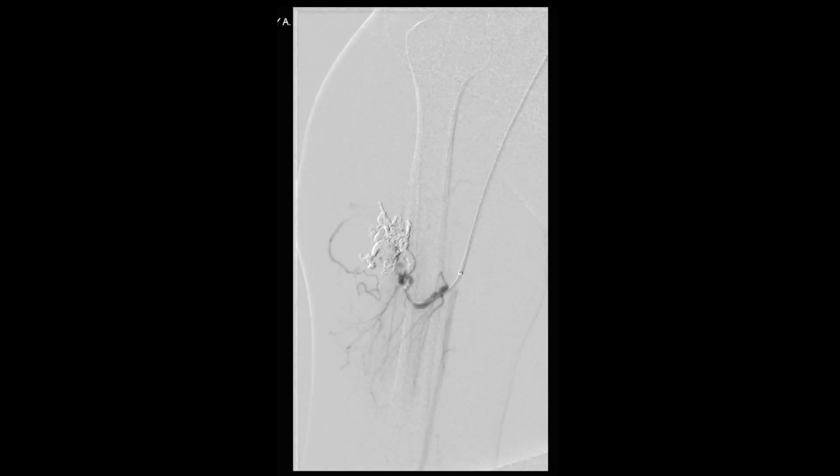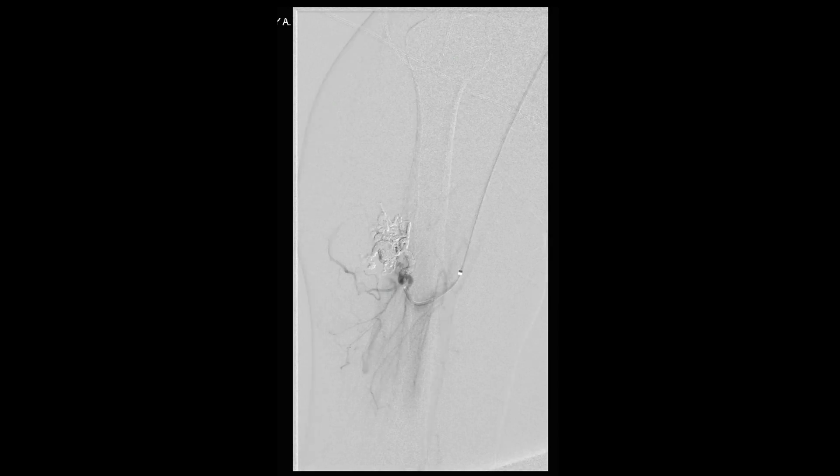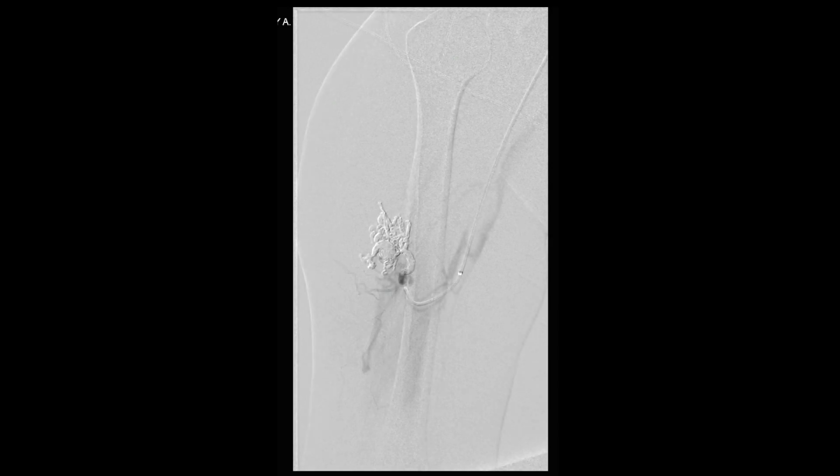A repeat angiogram was then performed that demonstrated cessation of flow into the AV malformation from this branch of the brachial artery.